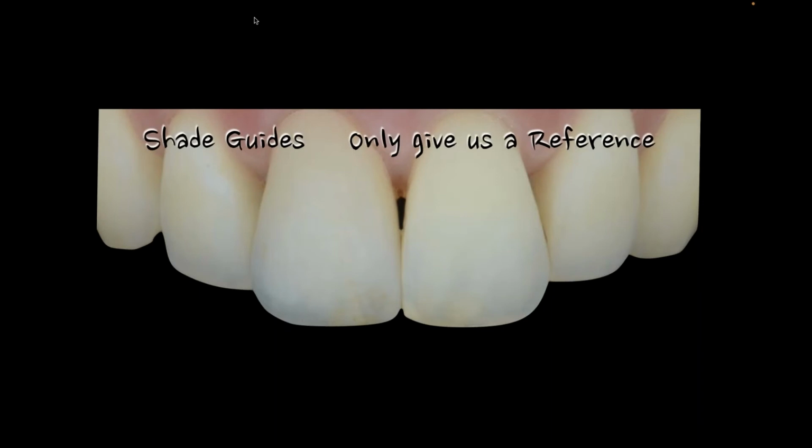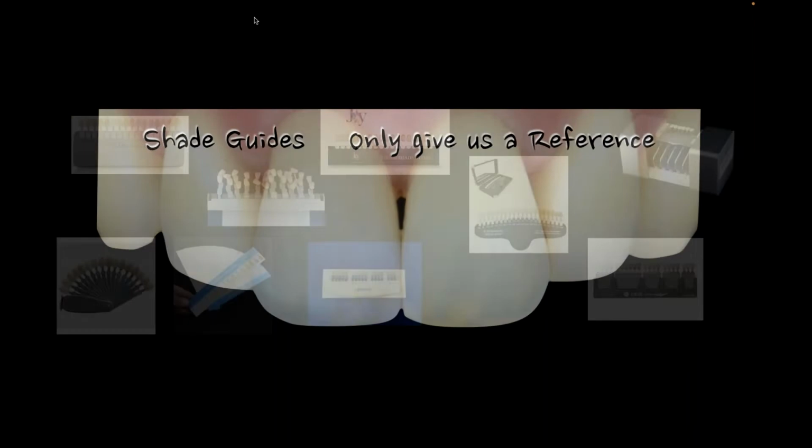I'm sure you've heard me say over the years, in lectures, and for those of you who have paid attention before, that when a doctor asks us to match a shade guide exactly, my argument would normally be that they don't really understand what shade looks like, because there is no such thing as a shade guide that has a perfect match to a tooth. It may have a similar value, a similar brightness or a similar hue, but never would you find a shade guide that matches a single tooth perfectly. It just doesn't exist. So that shade guide for us becomes a reference point.